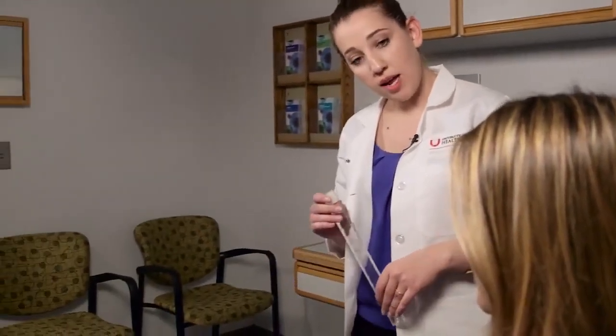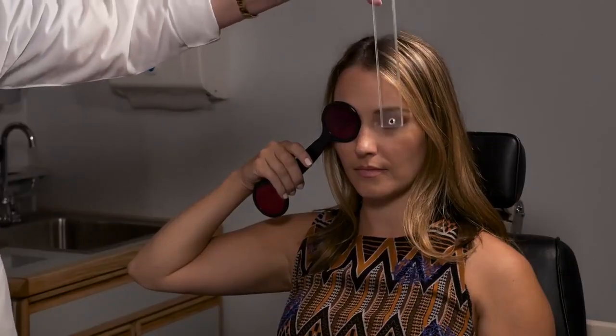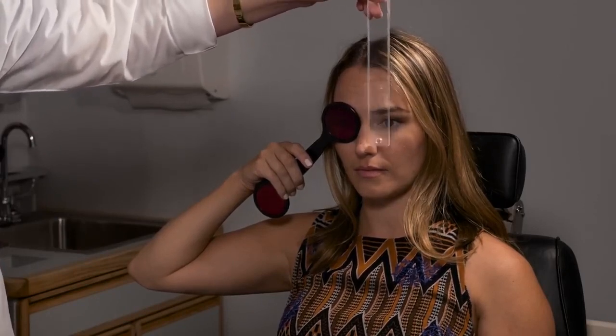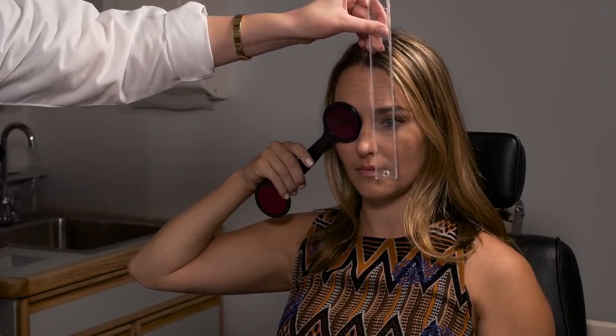Okay, I'm going to show you how to measure the deviation with a Maddox rod. So let me again have you hold that up there. So she's very well aligned, but for argument's sake, let's pretend that she had a vertical deviation. So let's pretend that the white light is above the red line. Okay. So you can use a vertical prism bar and add more prism. Since the white light is above, I'm going to be correcting a left hypodeviation. But you add increasing prism until the patient tells you that the white light and the red line are perfectly aligned.